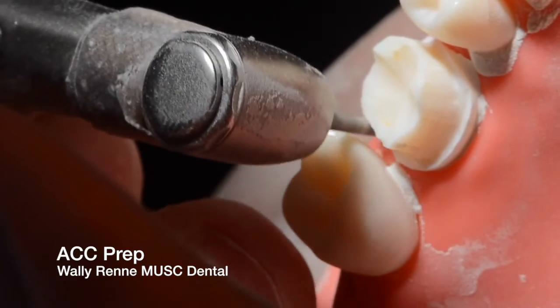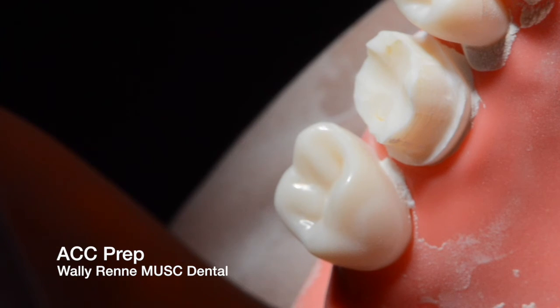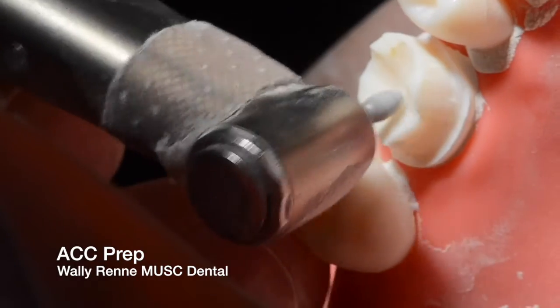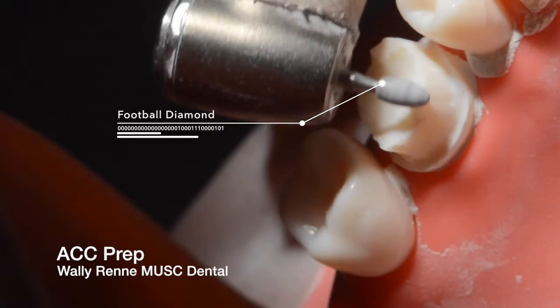A weak spot for students is the corners — the line angles of the tooth, both buccal and lingual corners. Make sure you go back and smooth those. But this is just a rough cut, meaning going fast, getting the outline, and then polishing after.